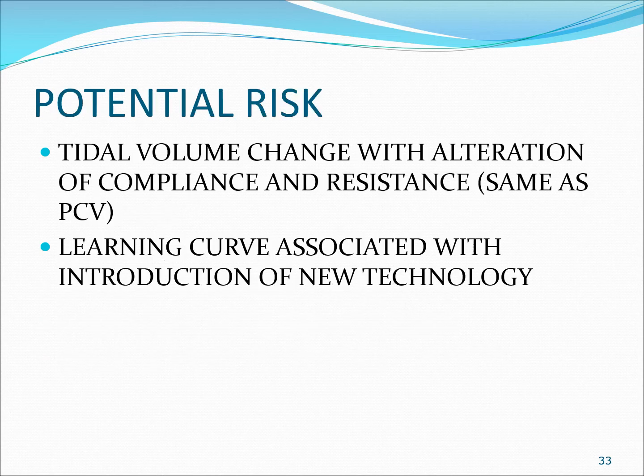What are some of the potential risks? I mentioned this earlier. Because compliance and resistance change in a patient, just as with pressure control ventilation, you might need to make some adjustments. Not crazy adjustments. Think about it: you're at the bedside taking care of patients, you make these little minor adjustments, and then you improve the mortality of the patient.